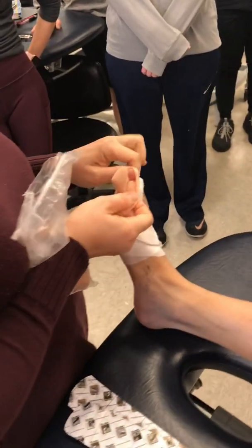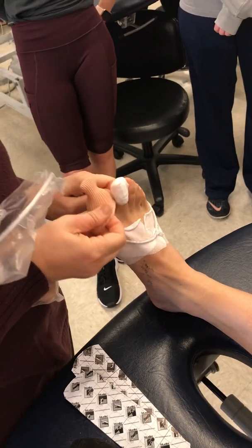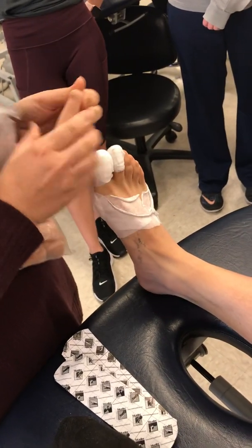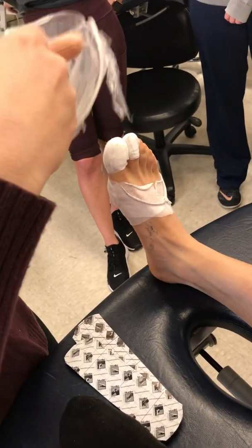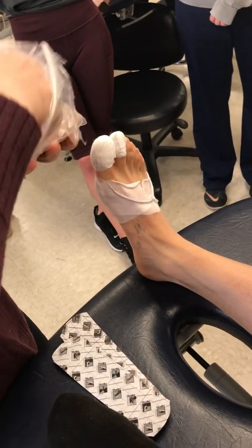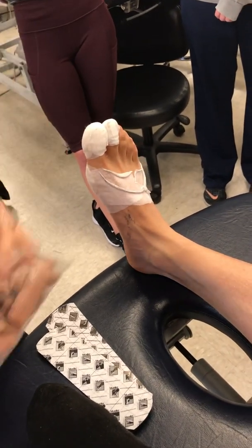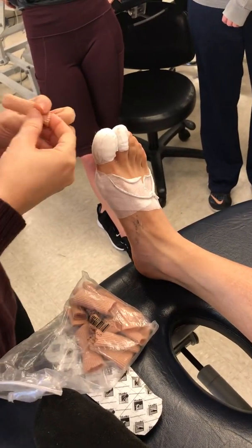This is for somebody who you don't want to be taping for so long, or they don't want to be taping. This might not be the right size. They have all different sizes. There's smaller, skinnier ones for the second toe and other toes, you got it? So lots of different sizes and options, but it would go just like that.